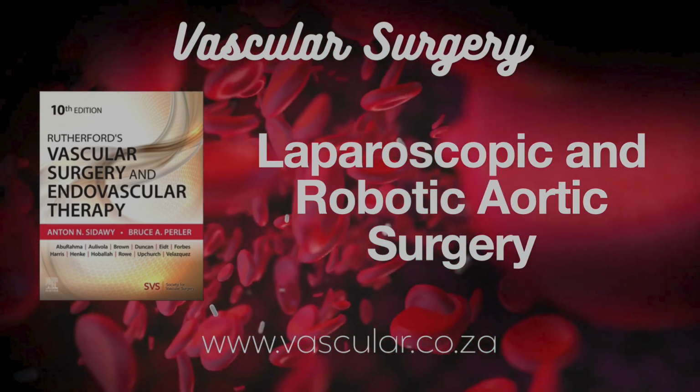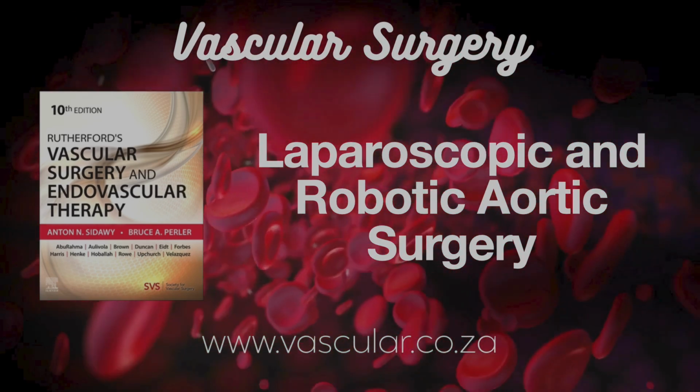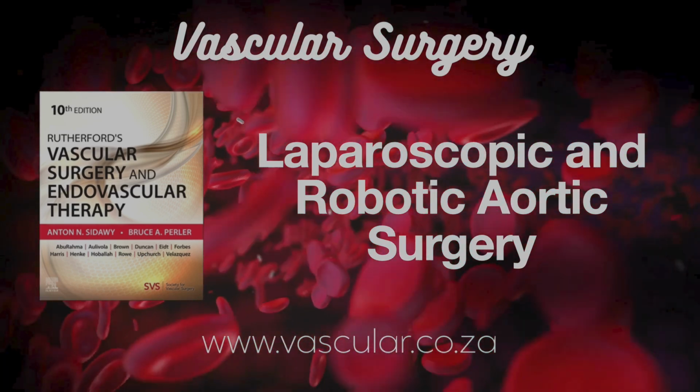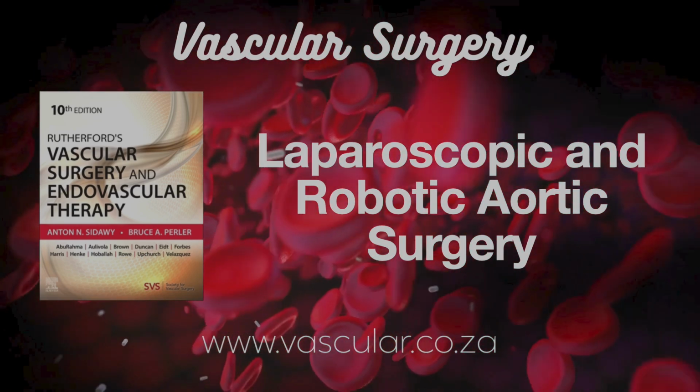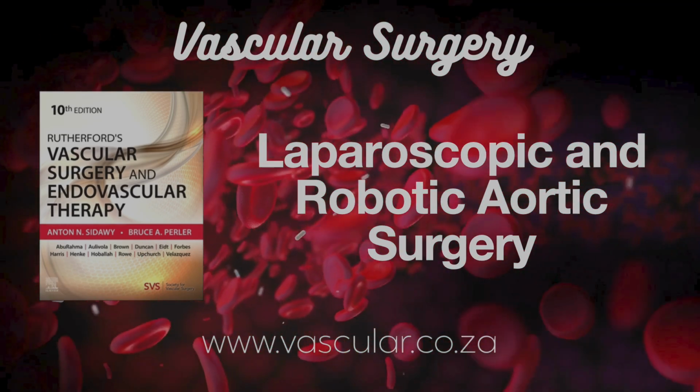Precisely. Patients are usually flat on their back, with a small cut, maybe 7 to 8 centimeters, often midline for that hand port. Okay. And the surgeon's hand inside is really useful. You can gently move bowel, feel the tissues, help with the dissection. That tactile feedback is a big plus. I bet. That must make a huge difference in feel.